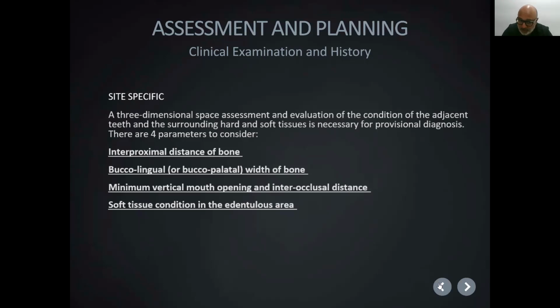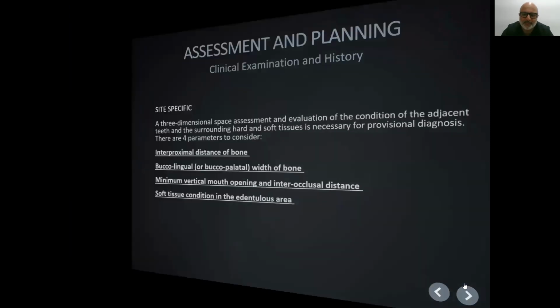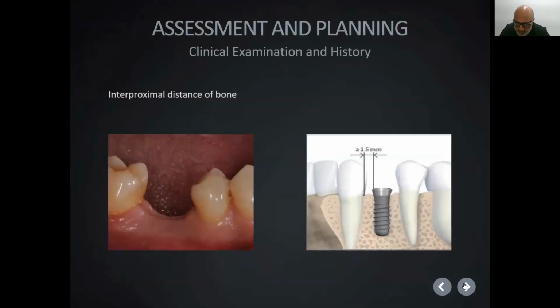Soft tissue condition in the edentulous ridge area. And we're going to be going through all of these so you understand them simply and fully. Really, they're not that complex. It's sometimes just made to be complex. Okay. So the interproximal distance of bone.